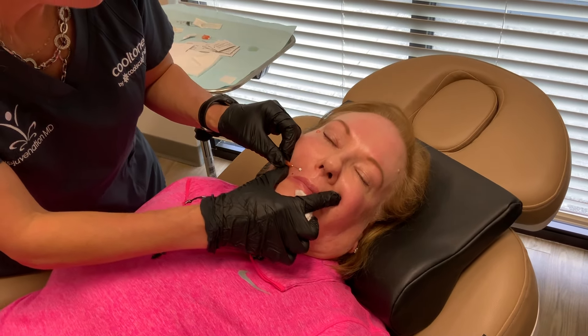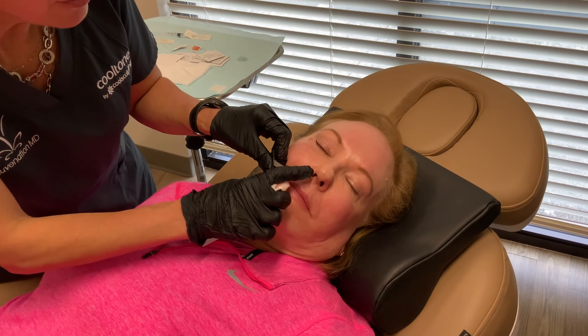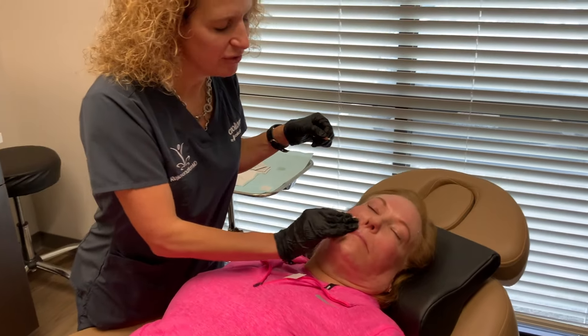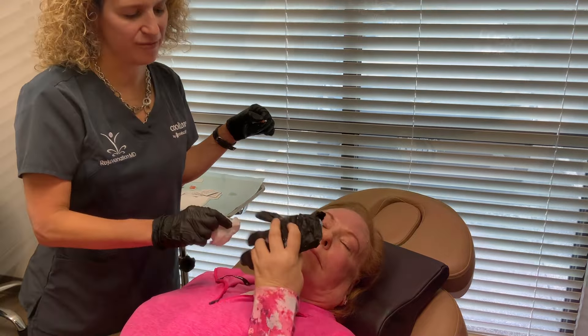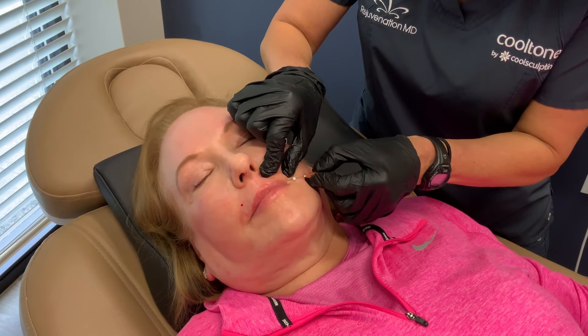One, two, three — and I'm out. All right, you did great. So we're going to go to the other side now. One, two, three.